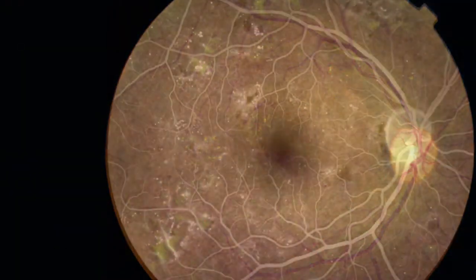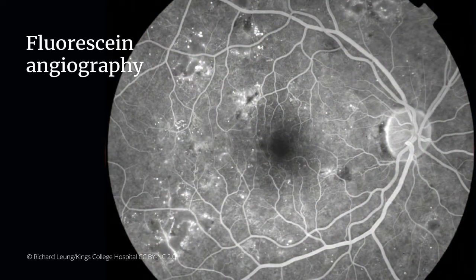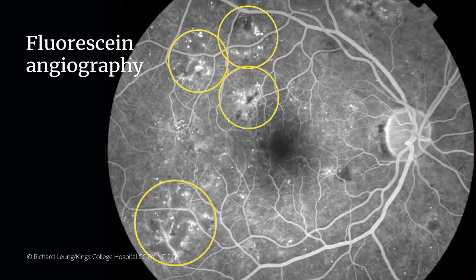Fluorescein angiography, or FA, is a useful diagnostic procedure which gives a real-time assessment of the capillary blood flow in the retina. It precisely indicates the areas of leakage or blockages in blood vessels and capillaries. FA can help guide the pan-retinal photocoagulation laser when treating proliferative diabetic retinopathy.